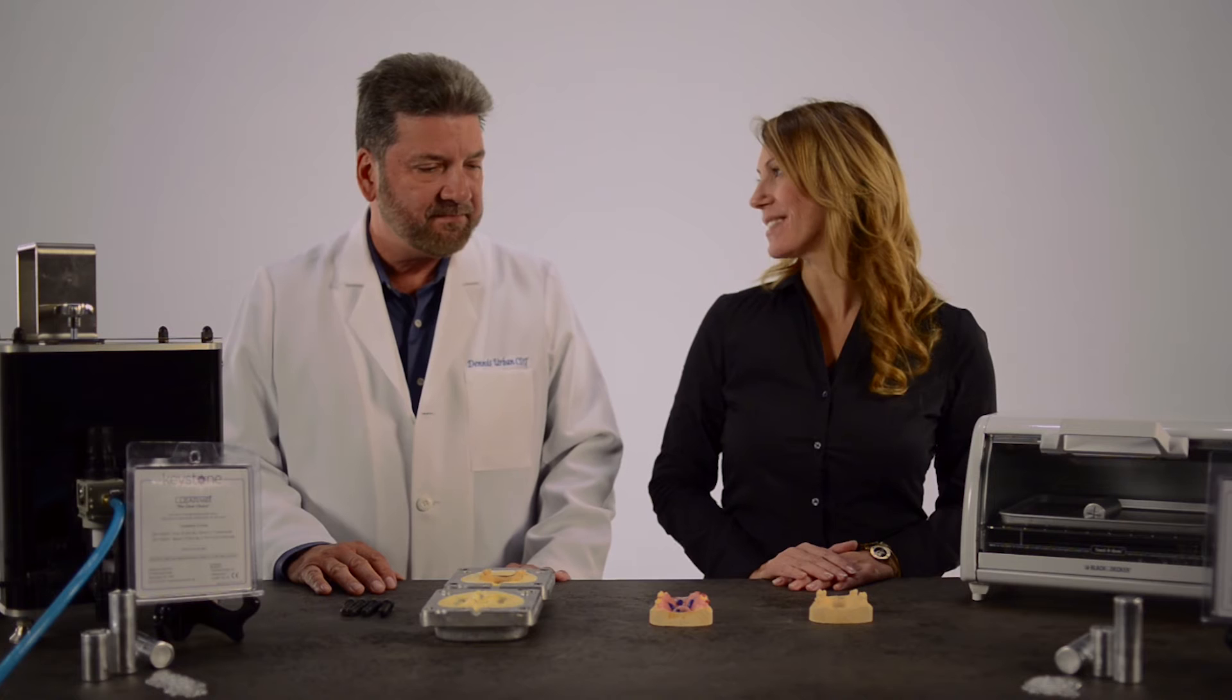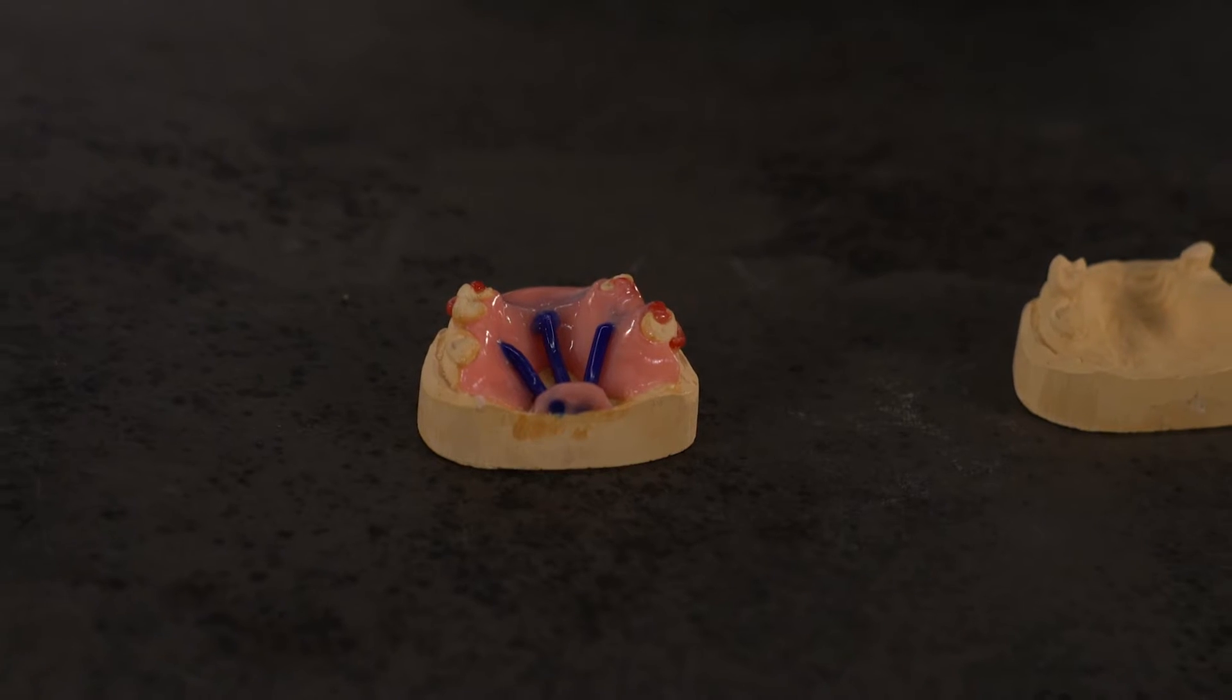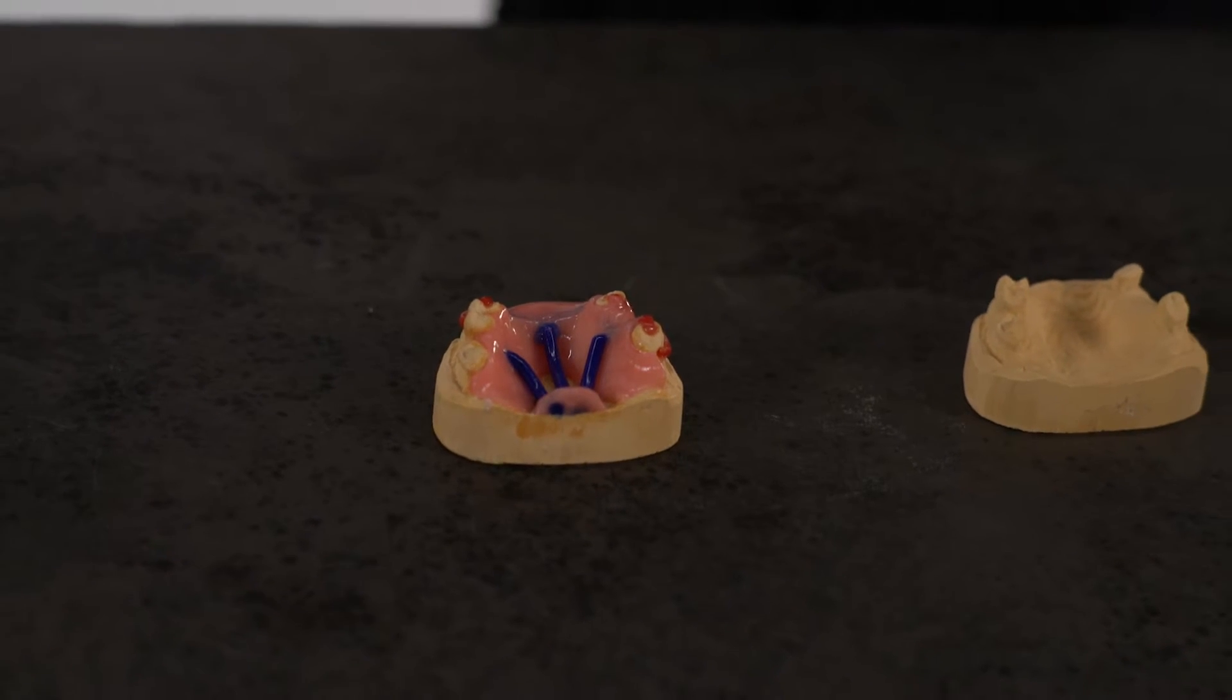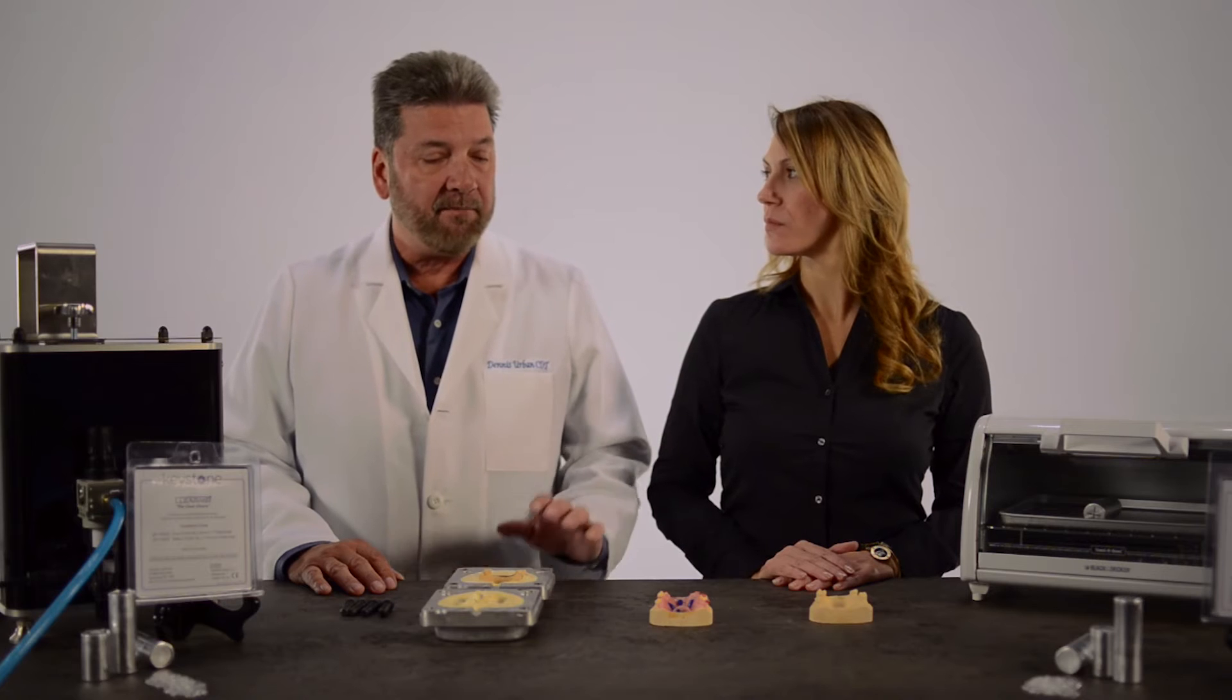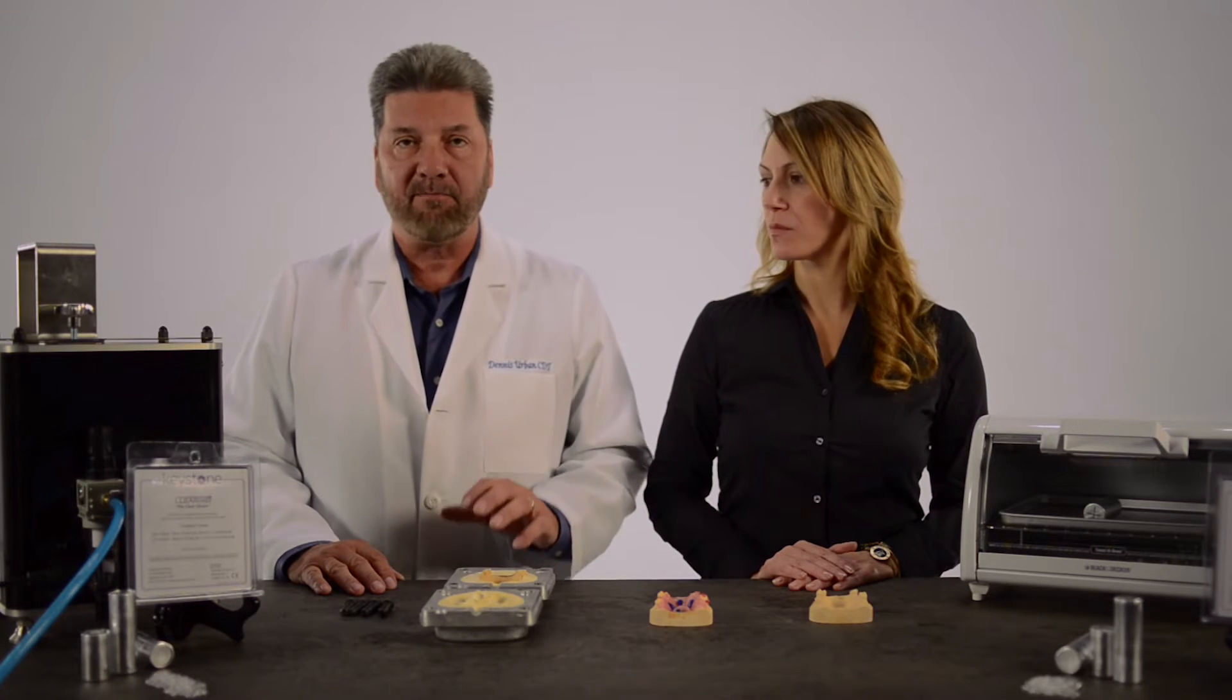And Dennis, what is it that we're going to see today? Well, today we're going to show the step-by-step procedure on how to fabricate a clear mat partial, showing from the waxing stage all the way to the finished product.